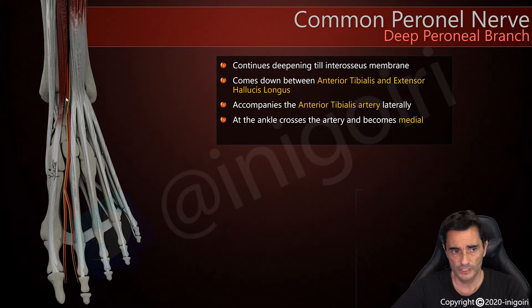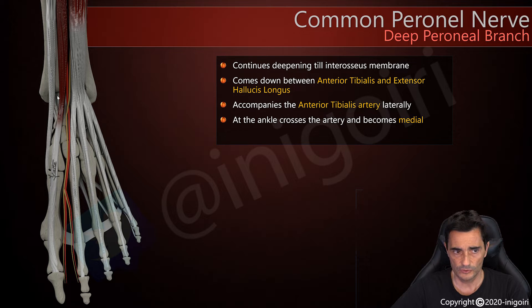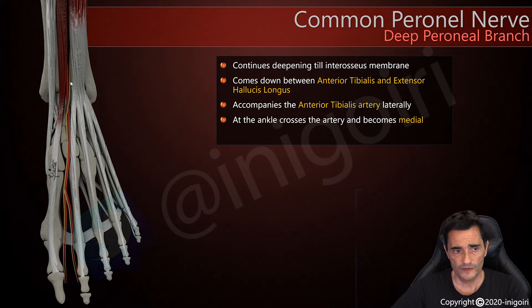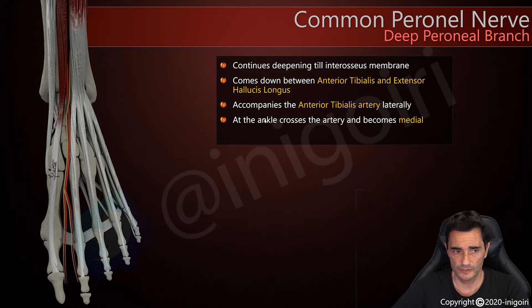We must always check the neurovascular bundle, which is located between the tibialis anterior tendon and the extensor hallucis longus tendon, in order to achieve a safe procedure. Interestingly, the deep peroneal nerve crosses the anterior tibial artery at this level — a curious anatomical finding, though not so critical in terms of diagnosis or prognosis.